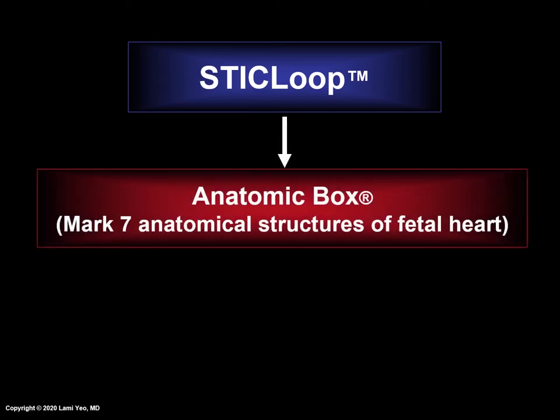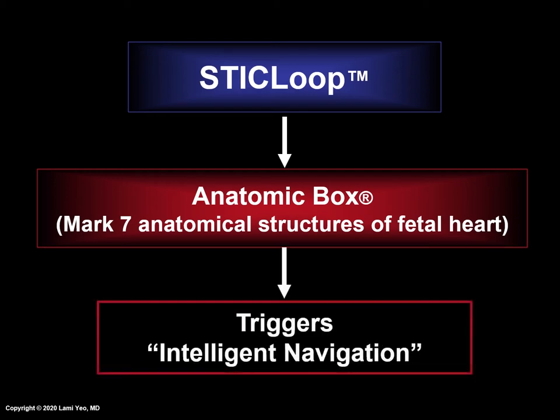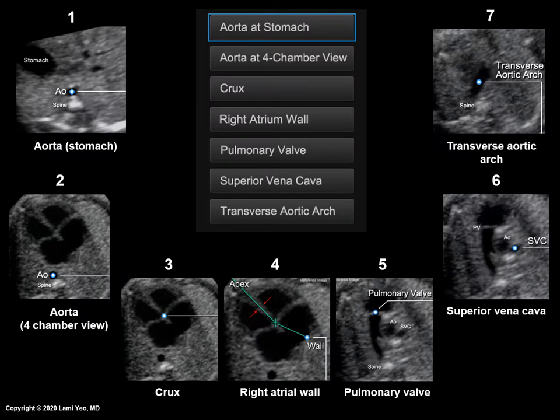As a brief reminder, after a STIC volume has been determined to be appropriate, the next step is to mark anatomical structures of the fetal heart using the Anatomic Box tool. Once marking is completed, this triggers Intelligent Navigation Technology. FINE teaches the user the seven cardiac structures that need to be marked and also where the marking should occur through reference images.